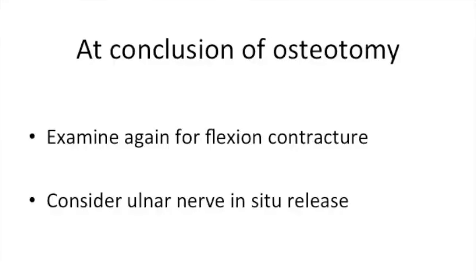Once sufficient bone has been removed to perform a closing wedge osteotomy, the distal fragment is flexed forward and the line of the anterior humeral cortex is aligned to match the contralateral elbow. Three 2 mm K-wires are inserted under radiographic control, 2 lateral and 1 medial, taking care to avoid the ulnar nerve. At this point, elbow flexion and extension is analyzed.